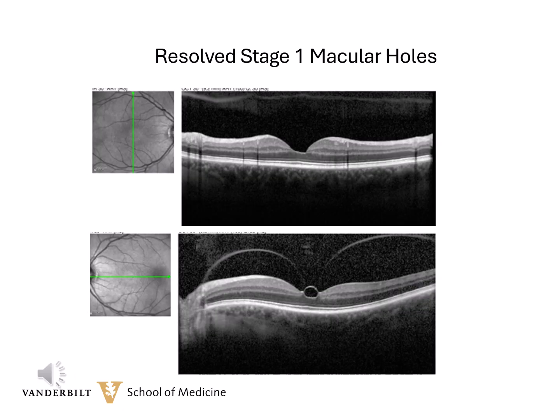Well, how do you know that the patient has had this particular problem? Here's an example of a patient with vitreomacular traction and a stage 1 macular hole in the left eye. You can see the parafoveal bursa and the traction on the fovea and an internal cyst. If you look at the right eye, there is a posterior vitreous detachment.